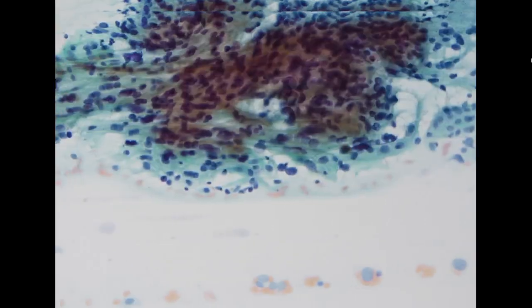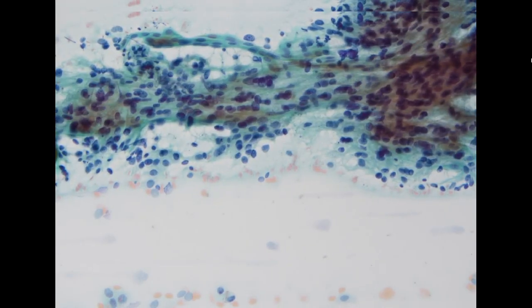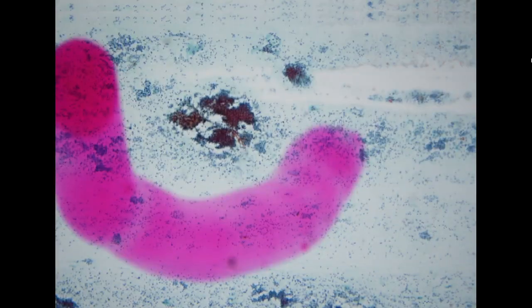As we know, if the patient has a squamous lesion, it is usually a focal lesion, so it would be present along the smearing direction. It won't be throughout the entire smear. Something unusual about this specimen is that there are areas where we start to identify more mature keratinized cells with nuclear atypia.